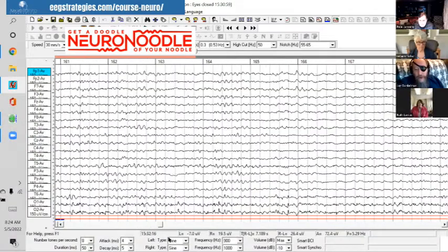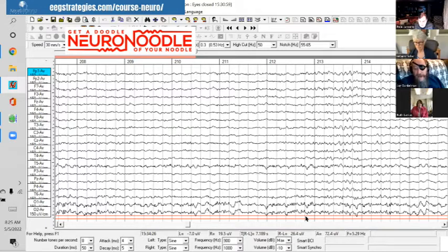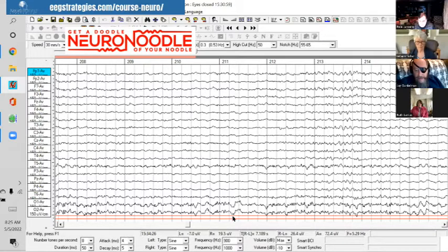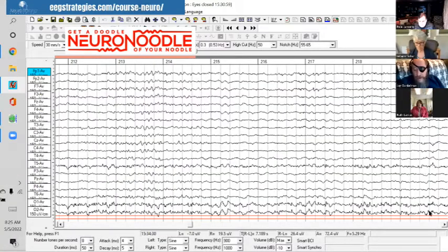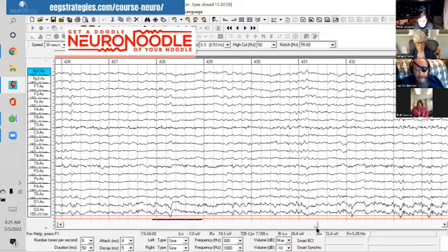But the transition to eyes open is a rather dramatic change. This is eyes open — look at the back of the head. These are lambda waves, and lambda is not a Greek term rhythm. It's an event — a P100 wave of an event-related potential. What we basically see is somebody who's got their amygdala charged up with emotion, fear, anger — a primary emotion. You basically change the thalamic gating, and the P100 wave arrives very large and early. We can't tell when the person focused on something. All we can see is the lambda waves at the back of the head, and they're not present in eyes closed because they're a visual processing-related event.